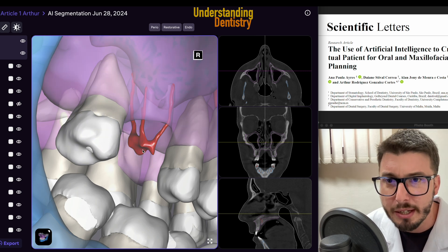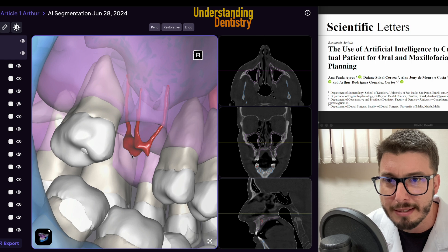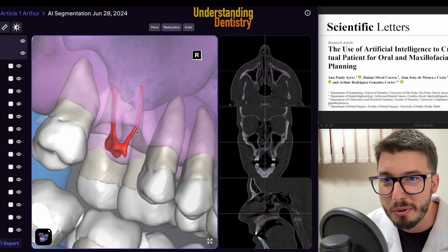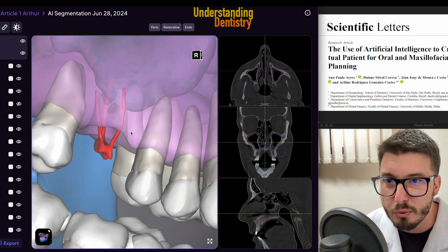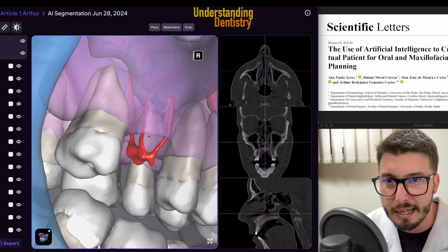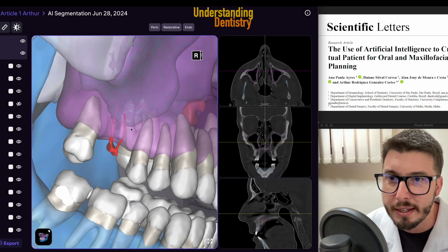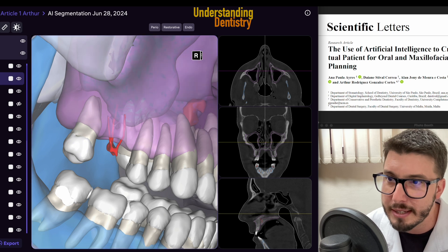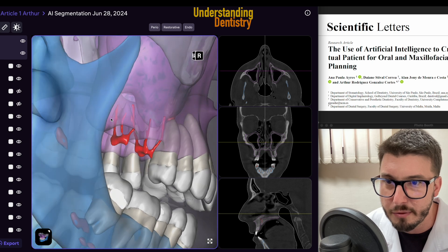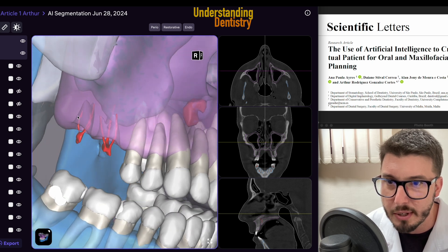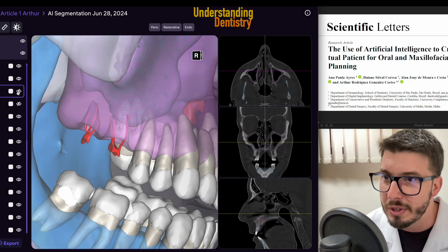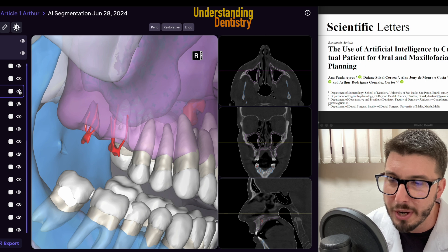Here we have the three root canals. The palatal root canal is behind the maxillary sinus, whereas both buccal root canals — mesial and distal — are in front of the maxillary sinus. Even the maxillary sinus is segmented here. Let's go with the 1.7 — similar stuff here, three root canals. We have all the canals; if they were treated they would be white, and even these would be recognized by the software.